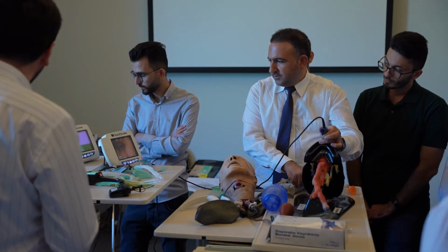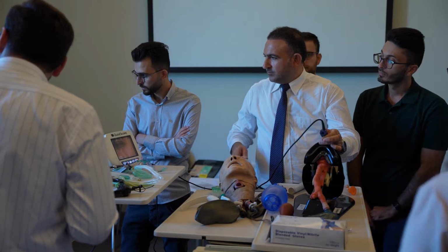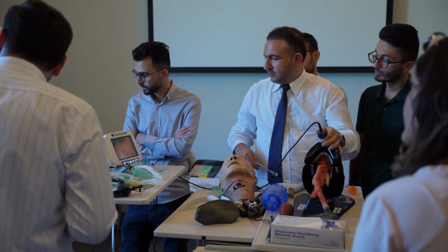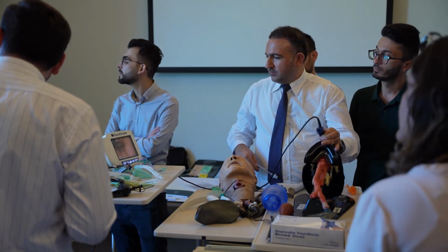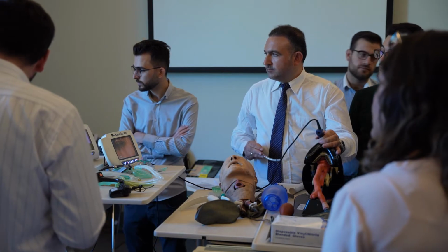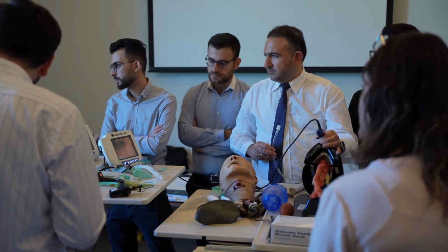How often are you going to do ambu bagging, I mean bag valve mask inflation? Every 2 seconds in pediatrics, and every 5 to 6 seconds in adults, which is 10 times in a minute, because the normal respiratory rate is 12. In order to achieve 12 breaths per minute, you inflate every 5 to 6 seconds.